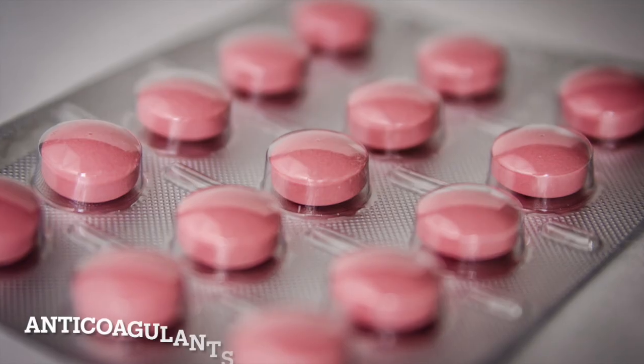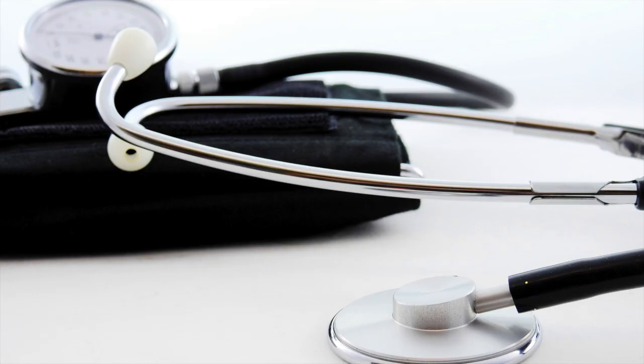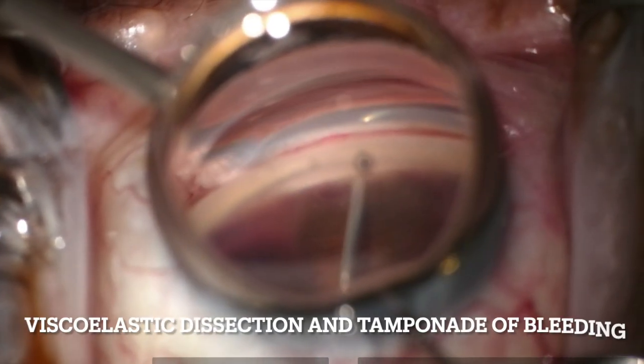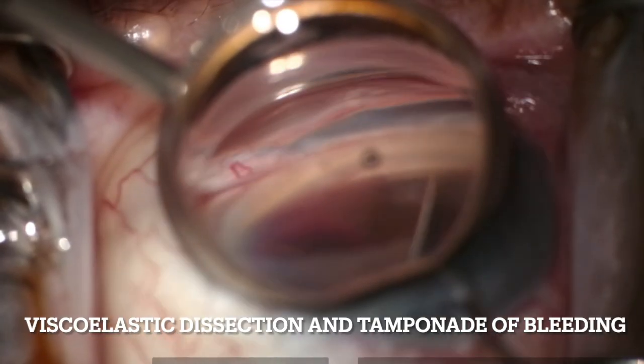Mitigation begins before surgery. Review anticoagulant and antiplatelet use when appropriate, while balancing systemic safety. Gentle tissue handling and controlled instrument advancement significantly reduce bleeding risk.